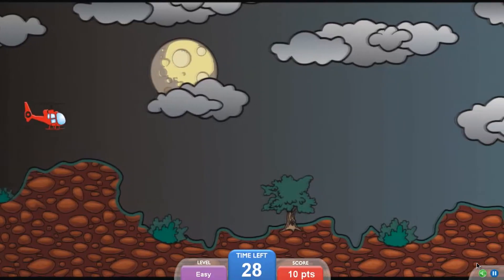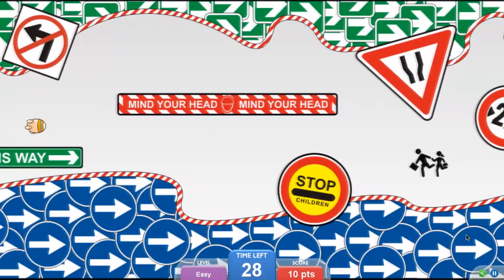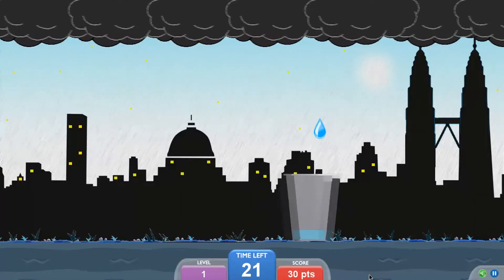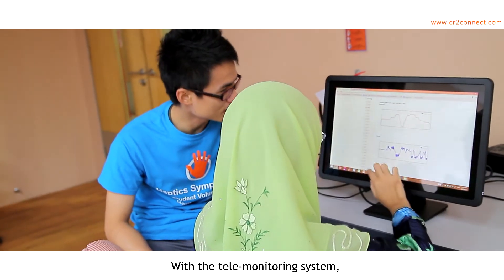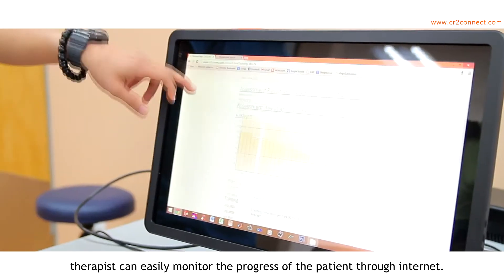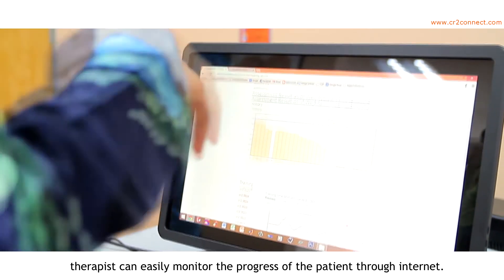It motivates the patient to train because the robot is able to provide different virtual reality games for the patient to play while they are training. With a telemonitoring system, the therapist can easily monitor the progress of the patient through the internet.